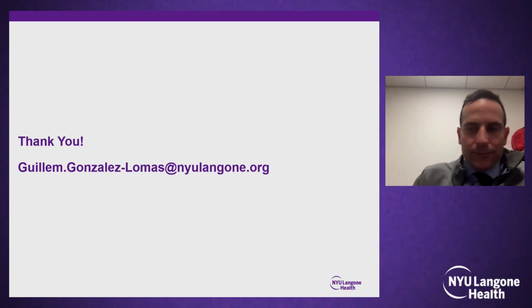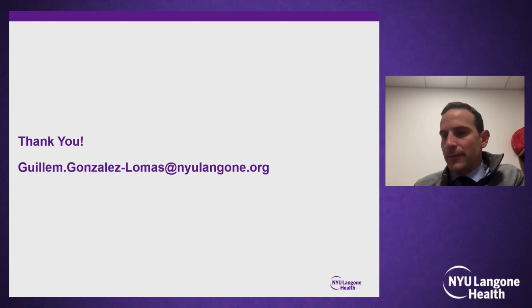Thanks, Guillem. That was great. I think the science is there. The techniques are evolving, and like you said, it makes sense. One thing you can tell your patient is when you put a scope inside, if there is collapse or major damage that was not visible on the MRI, you don't have to put that patient through a 6-month recovery. You can kind of go in, go out. So I think there's definitely utility to arthroscopy.